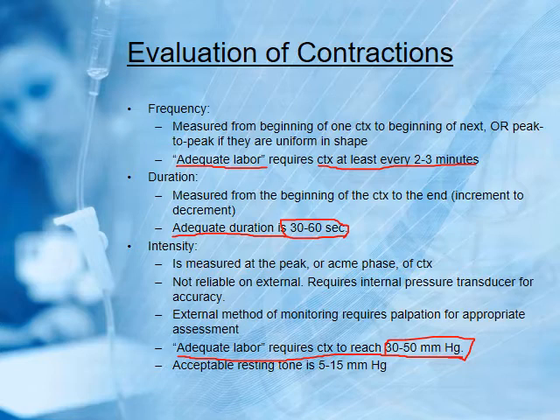Additionally, the resting tone. The uterus has a tone even when it's not contracting, and that tone is important to make sure that we don't have a high intensity tone always on the baby.